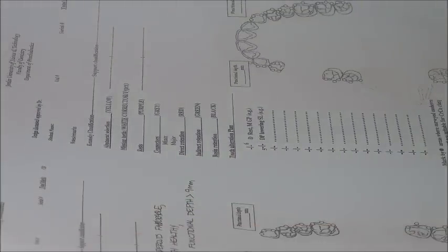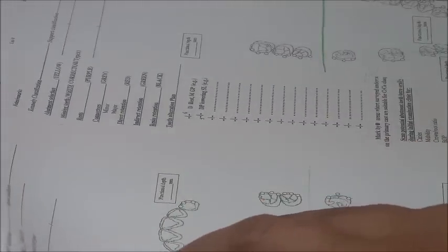What are the cases where I don't add components for indirect retention? If I have quadrilateral or a 3-point tripod rests. What are these? Go back one stage, 2 pages, please. What is quadrilateral support? Page 3, left design.